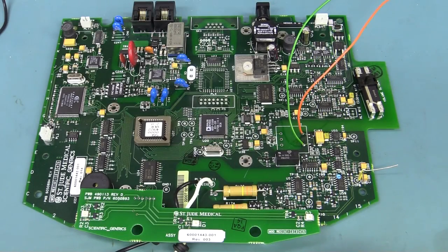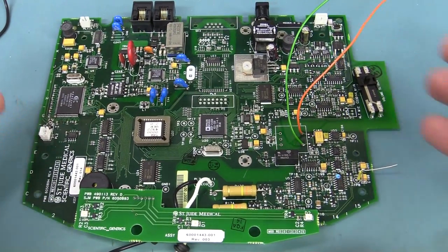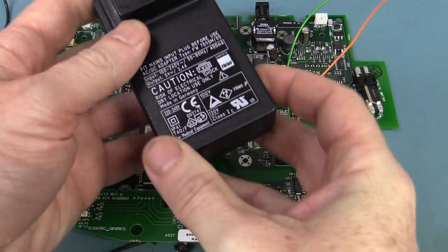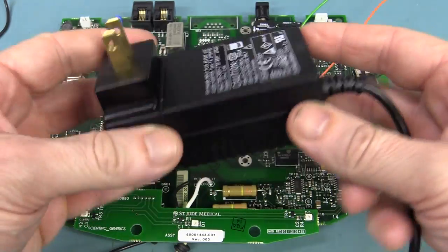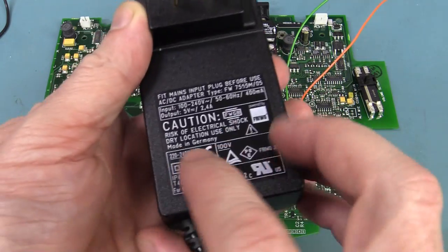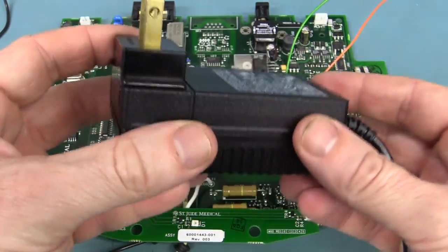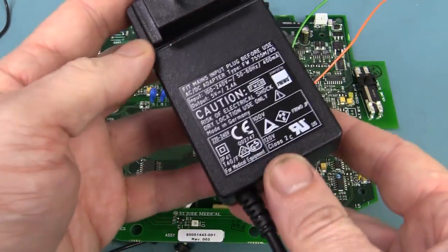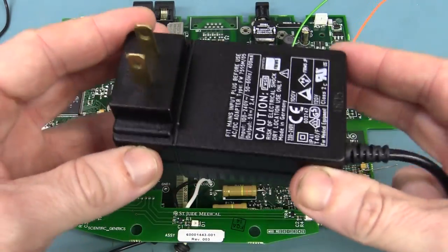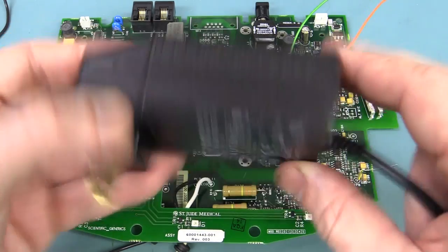Hi, welcome to Teardown Tuesday. As part of the recent teardown for this St. Jude medical pacemaker monitoring system, it came with one of these medical grade power supplies and everyone wanted me to tear this down — tear down this plug pack — and see what's inside. A proper made in Germany, beauty. Hi to all my German viewers. Made in Germany, medical grade, which would come under certain type standards.